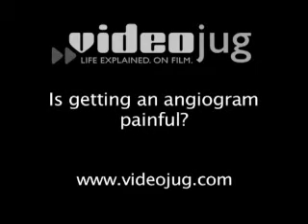Is getting an angiogram painful? The procedure of an angiogram is by and large painless. However, there are portions of the examination, such as the initial introduction of the catheter, that may require the introduction of some local anesthetic to numb the area where the catheter is being introduced. That may give you a little bit of a burning sensation. Injection of the contrast material into some of the blood vessels could also give you either a warm sensation or sometimes a burning sensation in that area.